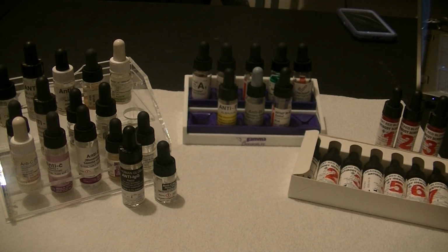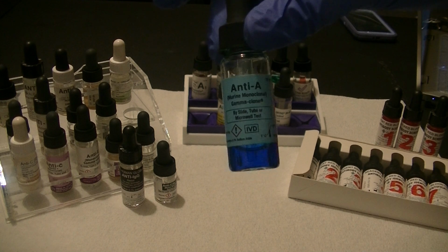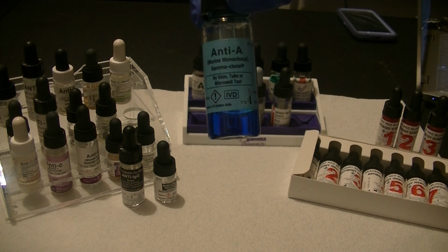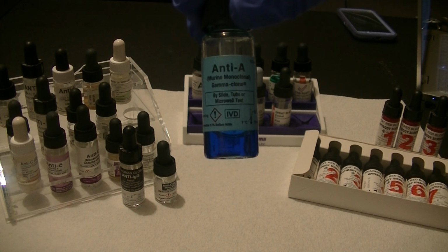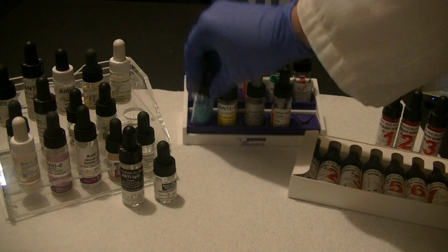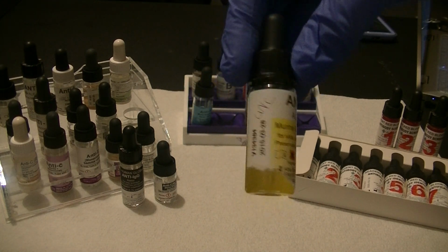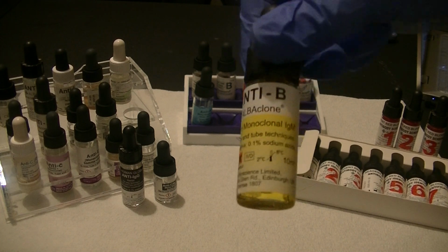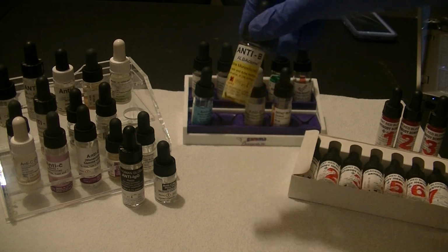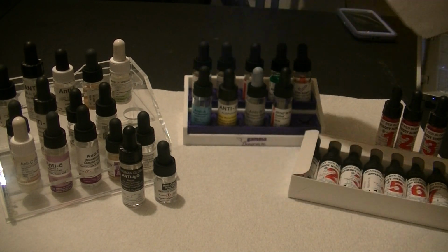In MLT intro course in Phase 1, you were introduced to anti-A, which is an antibody that will bind to antigen A on a person's red blood cells if they have type A blood. Anti-B is an antibody in a bottle that will bind to antigen B on red blood cells if they have type B. Both will bind if the person is type AB.